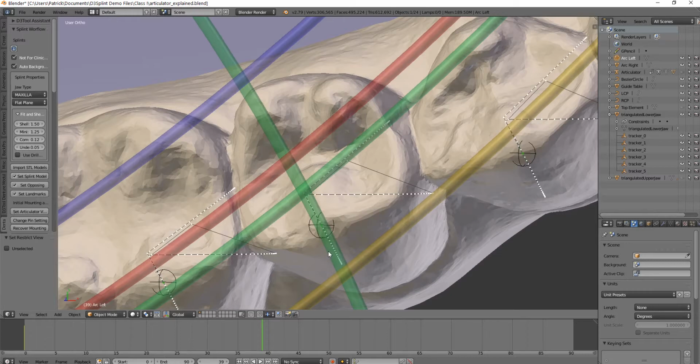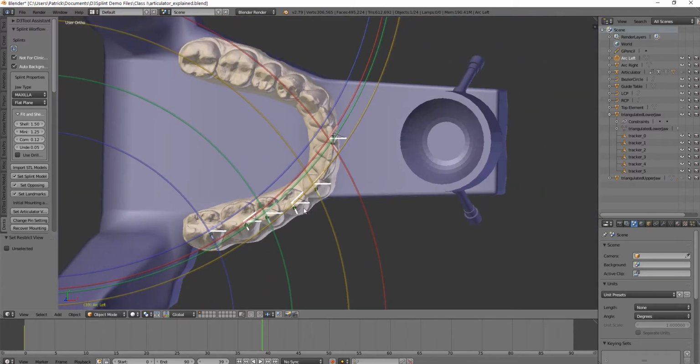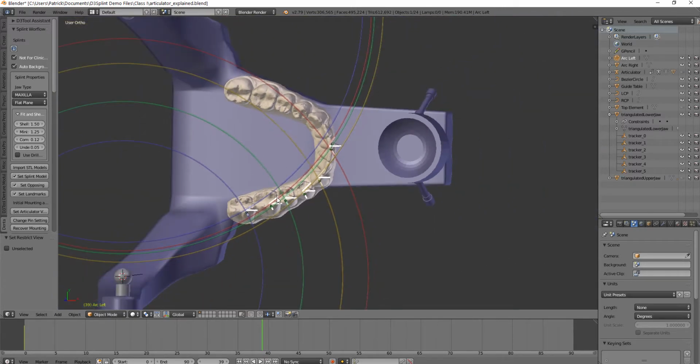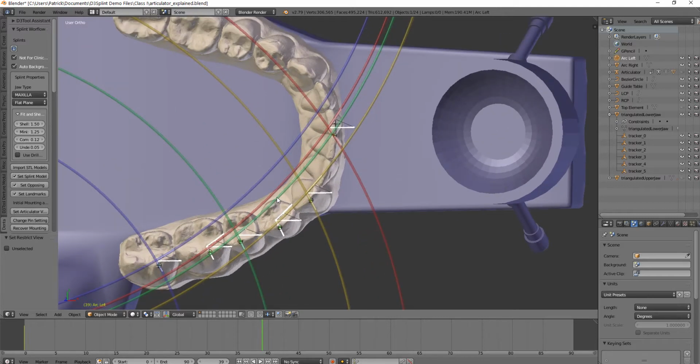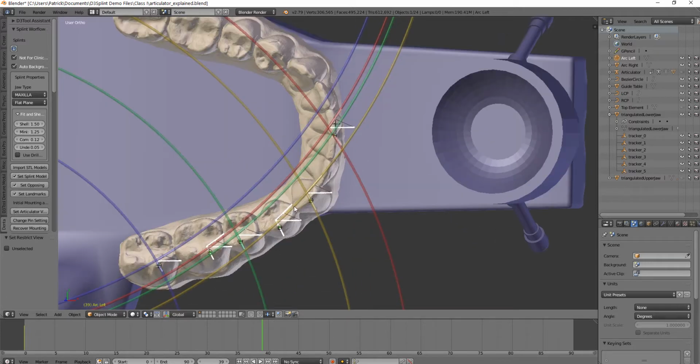extremes of the articulator movement, the simulation starts to break down as this track starts to exit the center of our expected arc. And that is a whole other discussion for why that's happening, but certainly every articulator is an estimation. And so I want to go over that limitation that this is probably not precise enough for large fixed rehab, and it was never intended to be, but it is a pretty decent linear semi-adjustable articulator.